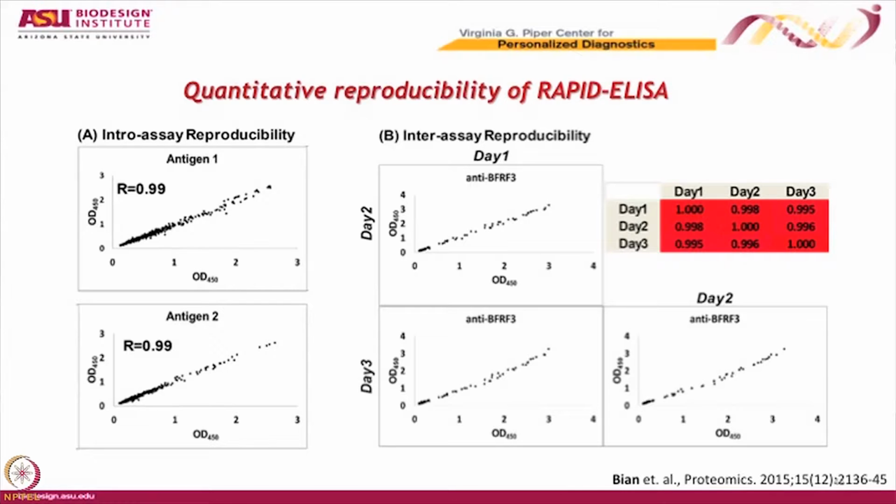And now I want to just show you that the ELISA assay is also reproducible. And again, you don't want to trust any clinical studies where you can't show reproducibility. So here what we're doing is basically looking at a variety of different antigens. These are 2 different antigens, comparing them on 2 different days using the same assay, using all of these different samples, probably 96 different samples here. And again, you see that from day to day, you get the same answer when you use the same platform. This is within a day on 2 identical plates, and this is between 2 different days. And then just showing you some examples, the correlations are typically close to 1.0, which means that they align very nicely.